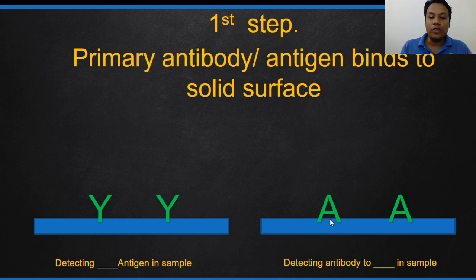And if you want to look, for example, at a patient that has already been infected with COVID-19, you want to know whether they have an immune response, whether they produce antibodies against the infection. So we need to put the antigen that we want to look for here. For example, if we want to look for antibody production in a patient against COVID-19, we place here the COVID-19 virus particle or antigen. This is the first step.